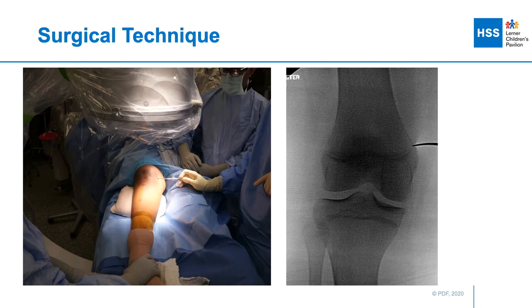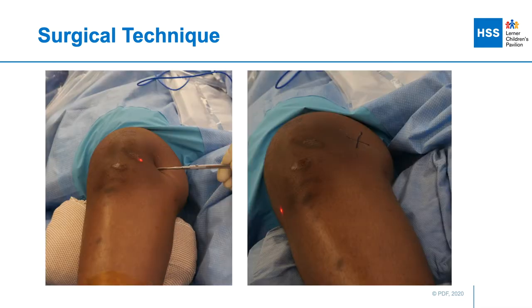We start by marking the level of the physis using fluoroscopy because this establishes the level of the incision. On a perfect lateral view, we also mark the anatomical axis of the femur, and the intersection of the anatomical axis of the femur and the level of the physis is the location of our incision, which is centered over the physis.